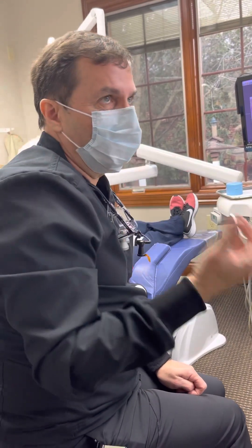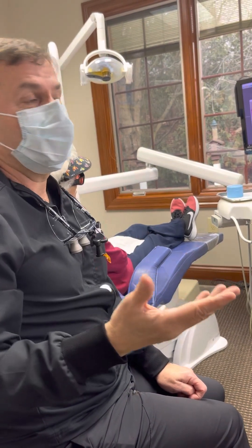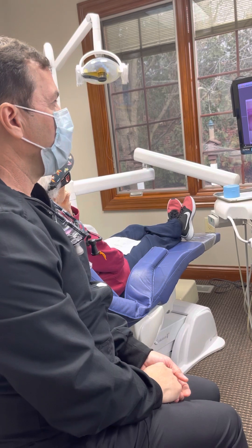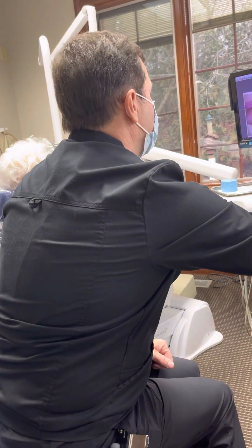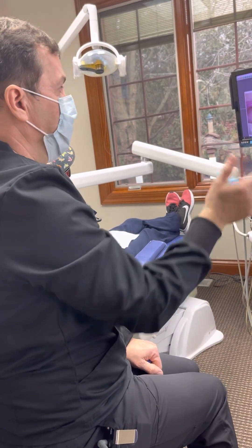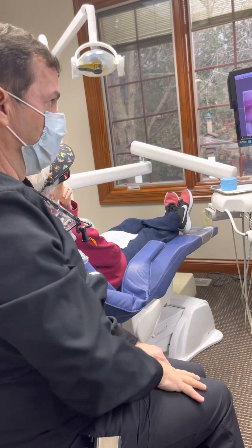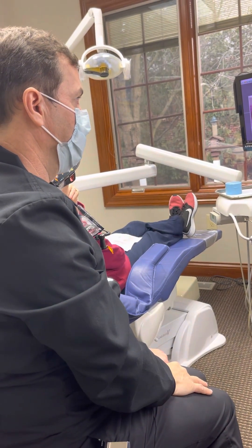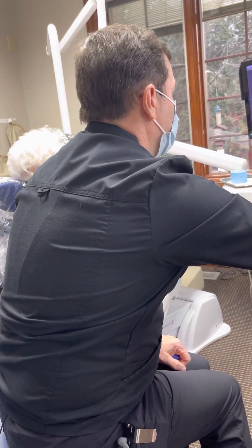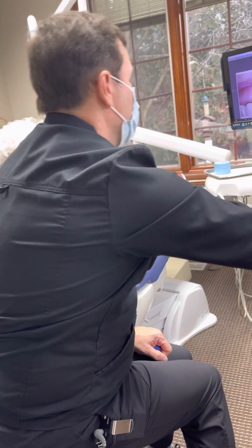The risk of not treating is that it could abscess, get infected, or do other things. This one on the far right had a root canal so it can still get infected; the one to the left has not had a root canal and is susceptible to an abscess. That little black thing you see on the right is no problem — maybe a metal fragment. The real problem is the cavity that's up under the gum.